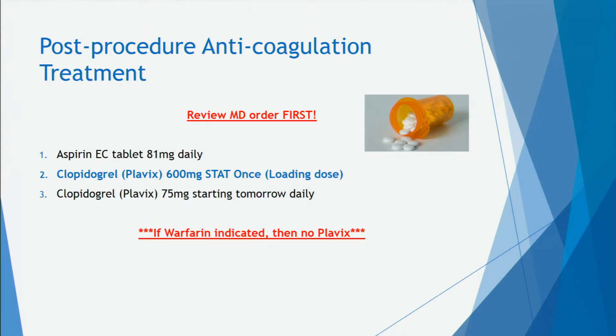On the first phase of TAVR coming up to the front from PACU, we were told in the staff meeting that the first group of patients in the first phase must have a permanent pacemaker. Yes. Okay. Yes. That's the goal, is the first ones will have permanent pacemakers already implanted.